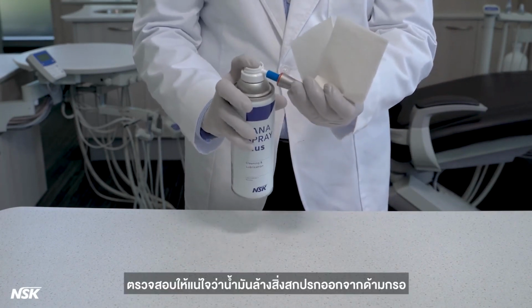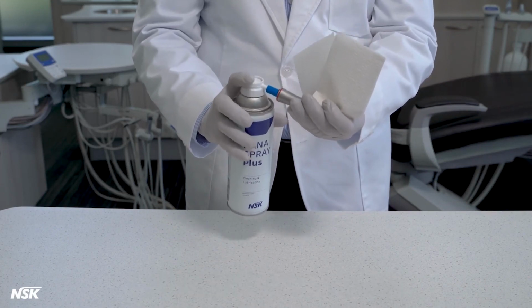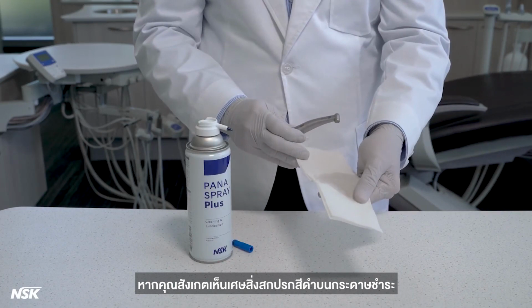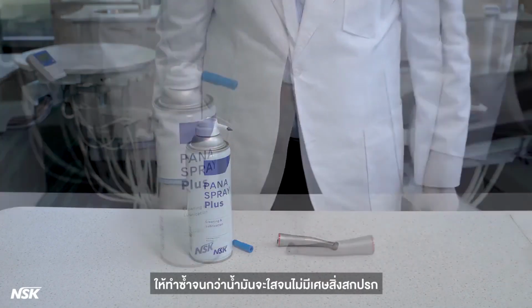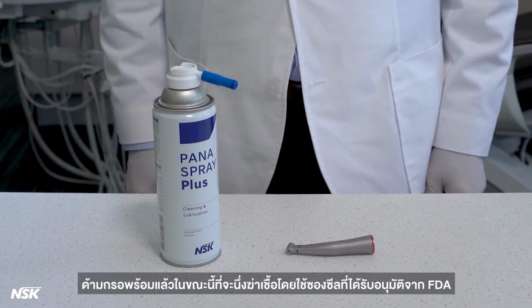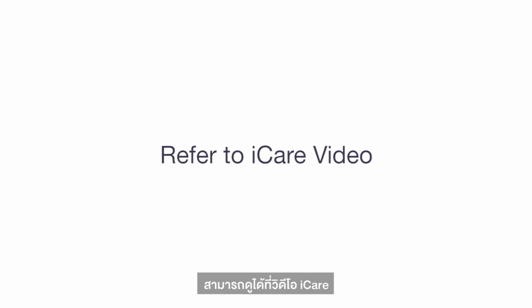Make sure the oil flushes the debris out of the attachment and clear oil comes out of the head. This should take a couple of seconds. If you notice black debris on the paper towel, repeat the process until the oil is completely clear with no debris. The attachment is now ready to be autoclaved using the FDA-approved pouch. For automatic lubrication process, refer to iCare video.